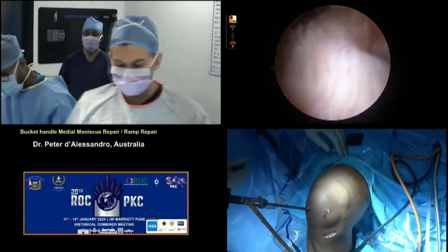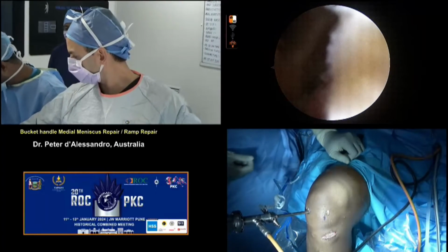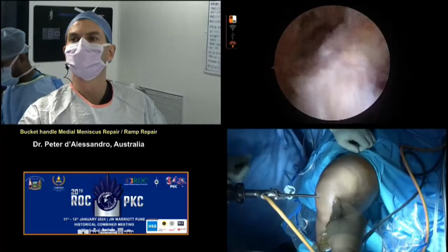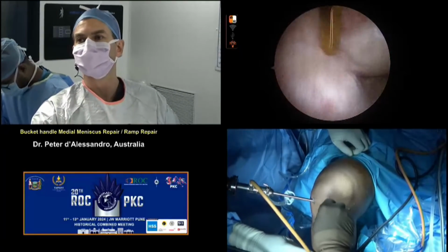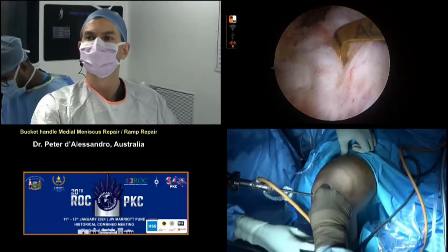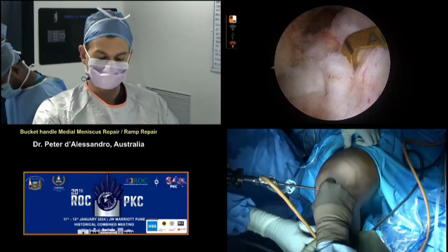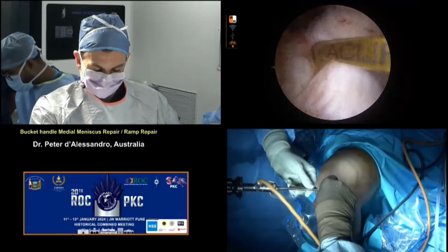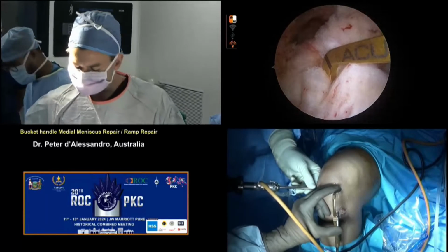In terms of graft size, I mentioned we'll go to the golden boy, and then we'll pass that. Yeah, tibial guide. Graft size, I'm a believer collagen is important, so it's always 8 or above for me on the hammies. But I do use the bigger size on the tibia, obviously for graft passage, because I'm coming from the tibial side. So we're using an elbow aimer here. Just hold the camera there for me, guys. So in terms of length, we're right on 40 there.